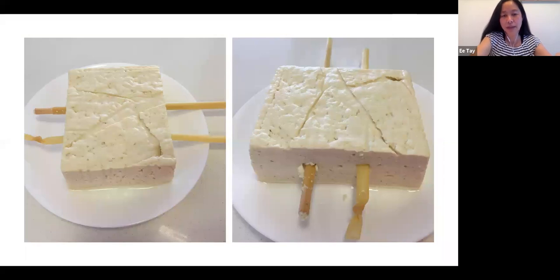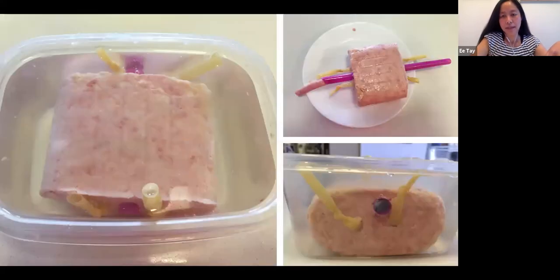So you can see on the right image there's a chopstick going through it, and then you have to somehow thread that balloon, the Penrose, on the other side, and then you take out the chopstick and then fill the balloon for the tofu. Okay. And I did the same thing with spam. The great thing about spam is that once you put the thing over it, especially your bubble tea straw, you have to suck out the meat on the other side, and that requires you to literally suck it out. And then I just immerse that whole thing into the water bath.